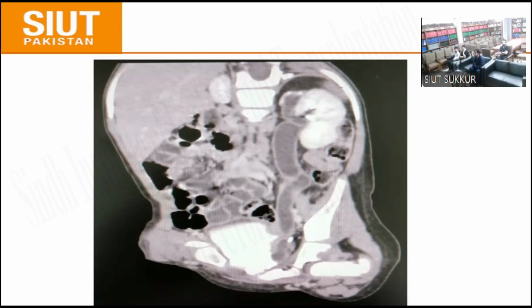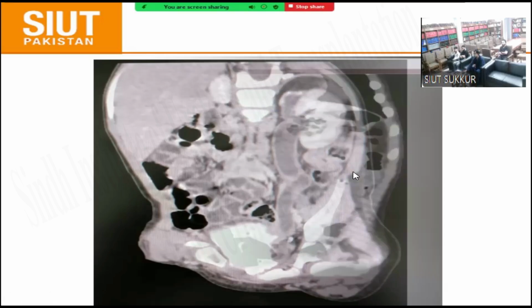So do you think the whole kidney is distorted, or only the upper moiety, the upper pole of the ureter, the upper pole of the kidney? You are right, this is upper moiety hydronephrosis, tortuous hydroureter and distal obstruction. Mid and lower pole are spared or intact. Sayat, proceed.